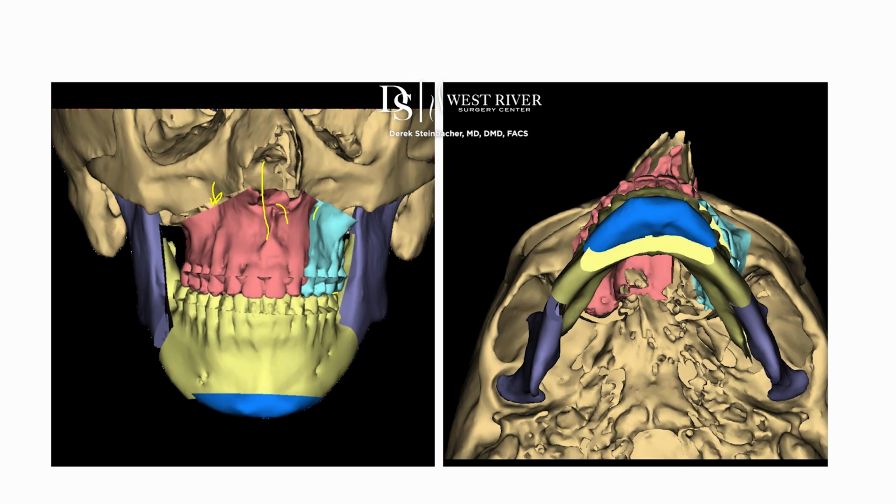We then look at the mandible and put the mandible in the right place, sagittally as well as from a frontal view, and a genioplasty with a custom plate to ensure that the chin is shortened and centralized as it should be. Sometimes looking from below here too, we can change the yaw position of the chin. We want to make sure the TMJs are adequately seated and that we know the amount of advancement or setback to help with planning of the plates.